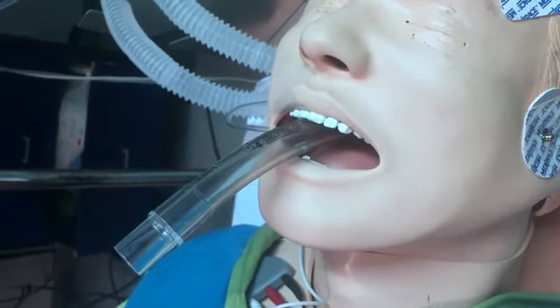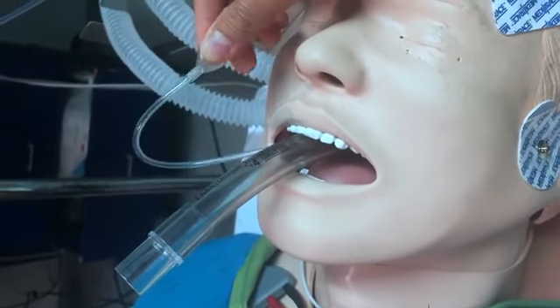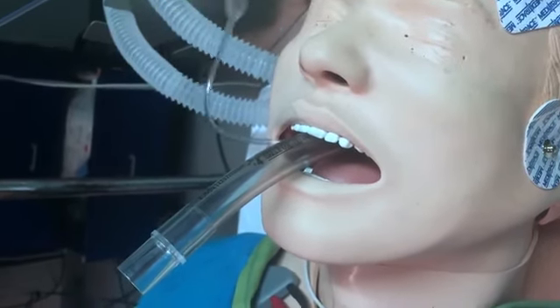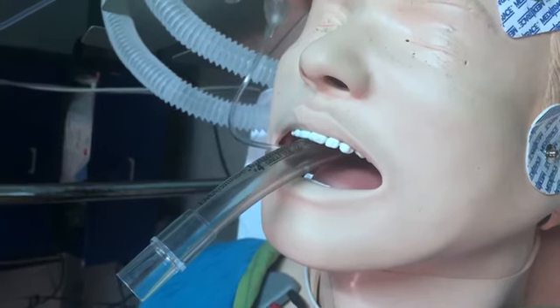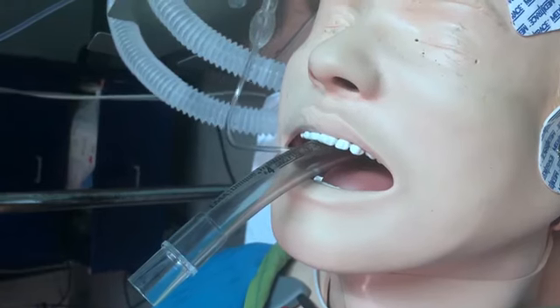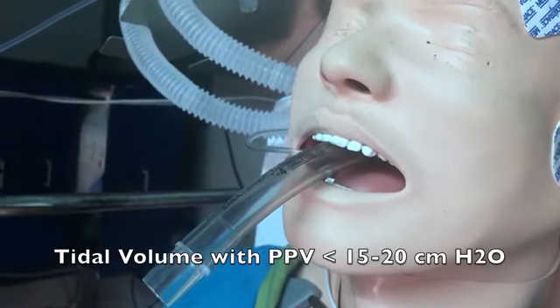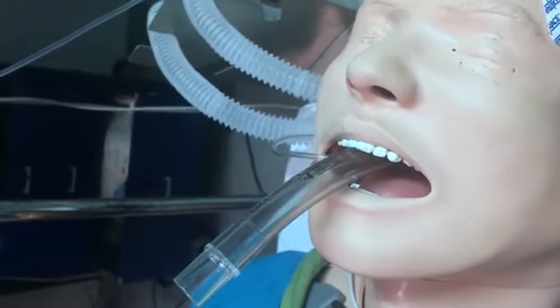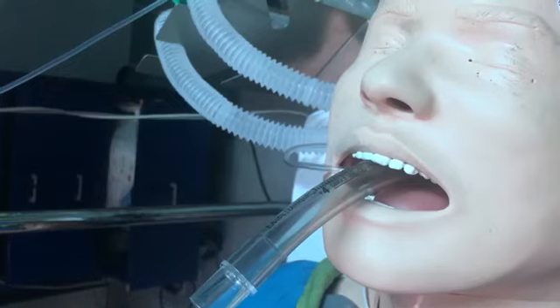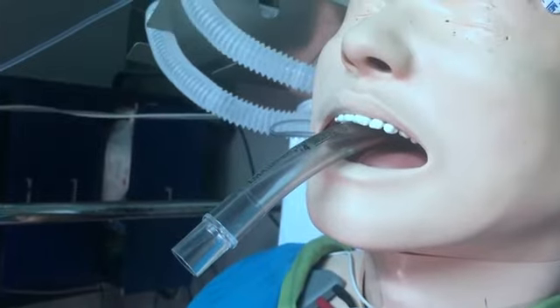Once you correctly place the LMA, you can insert air to get an adequate seal, and you have to assess if there is proper ventilation and if you have to add more air in order to seal it. You do that by checking for chest rise when you do manual positive pressure ventilation. You see if there's adequate tidal volume for the patient's weight with positive pressure ventilation less than 15 to 20 centimeters of water. Another way is to see if there's a minimal leak with airway pressure less than 15 to 20 centimeters of water. You can assess that by auscultating over the trachea over here. So those are the ways in which you put in an LMA.